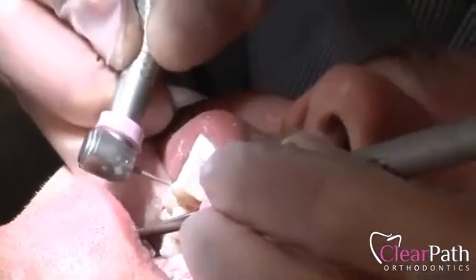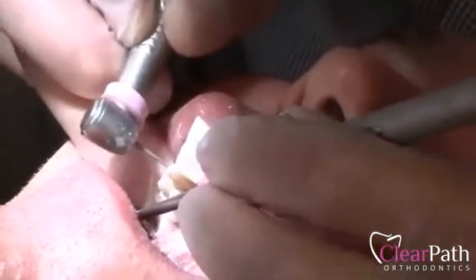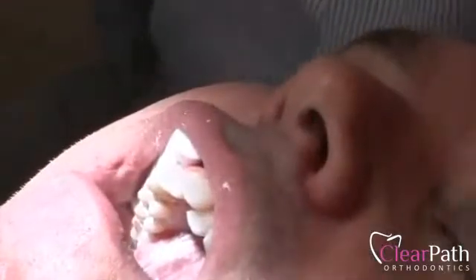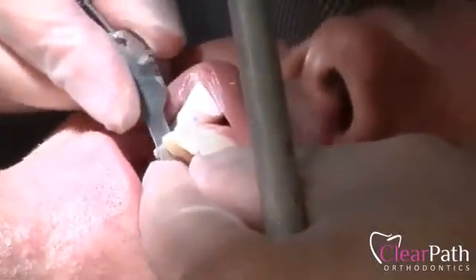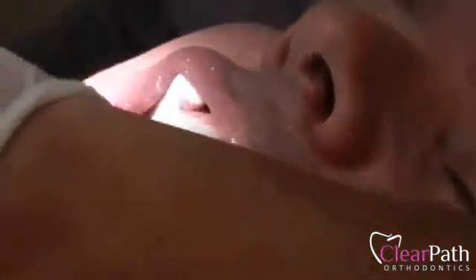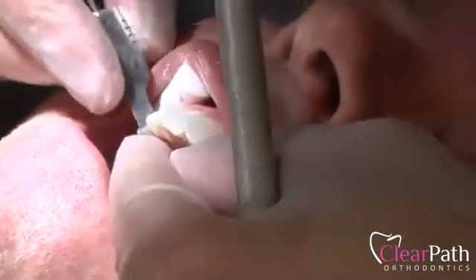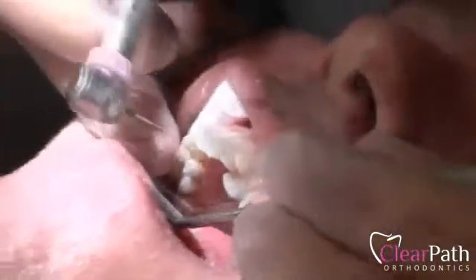Now we're going to go ahead and measure. I know I want 0.5 millimeters, or half a millimeter — a very small amount of each contact. So I'm going to use my little gauge. So that's 0.5. I'll just step down to my lower one, 0.4. We know it's just a tiny bit, so 0.1 millimeters. That's how precise the measurements are.